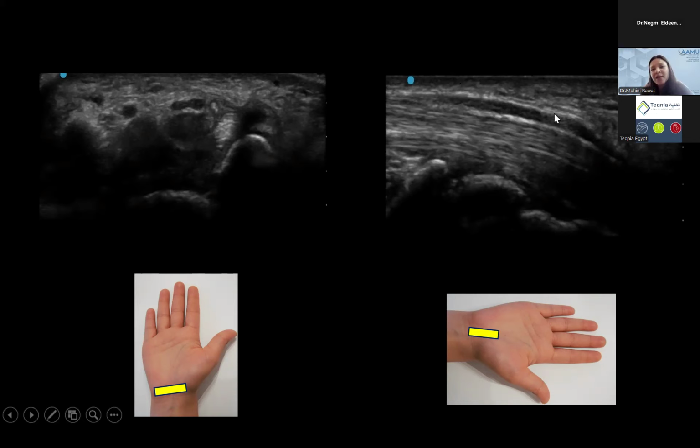Long axis, yes, there are some focal hypoechoic changes, and you can possibly say this is some constriction, but it's mostly a normal uniform caliber. There are many subclinical cases where people do not have compression or symptoms, but they may still show these kinds of pictures. So ultrasound is not really adding up. It's not consistent with the presentation in EMG.